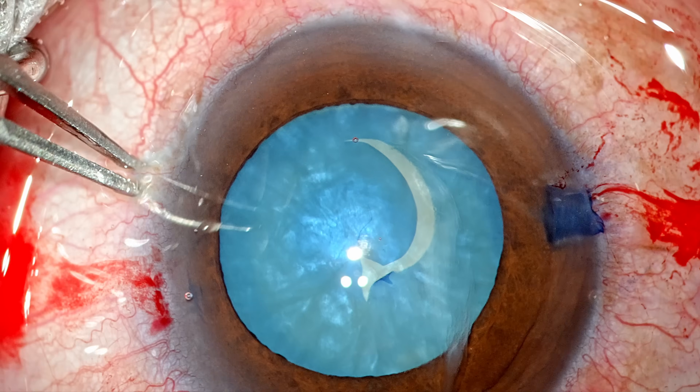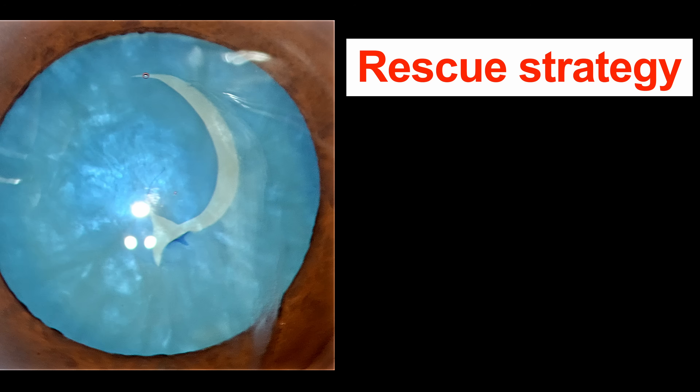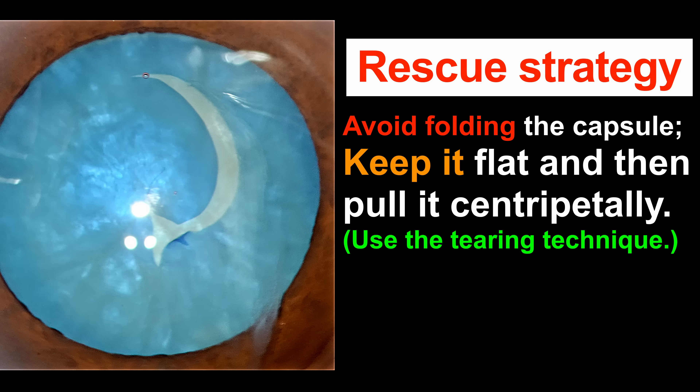Now I am going to complete my rhexis. At this stage I am in rescue mode. I don't fold the capsule — I keep it flat and then pull it centripetally. So I am not using the shearing method of creating the rhexis; I am using the tearing method. This is the strategy I use to perform the rescue maneuver.